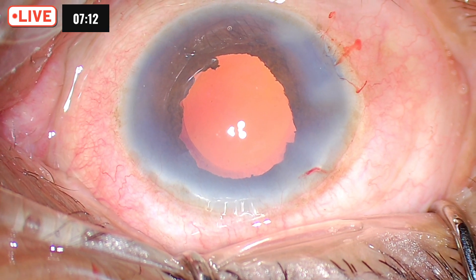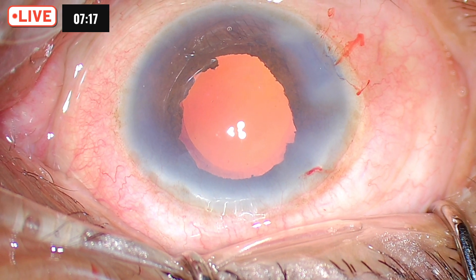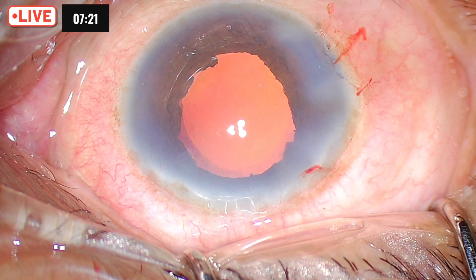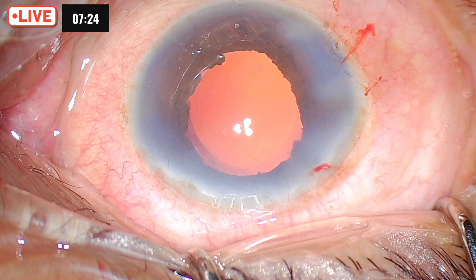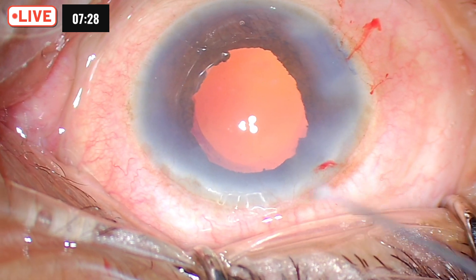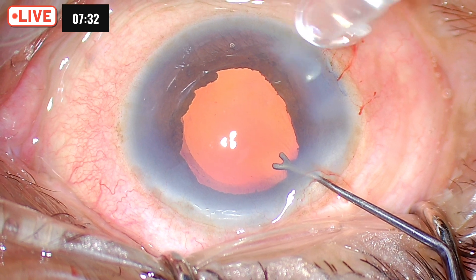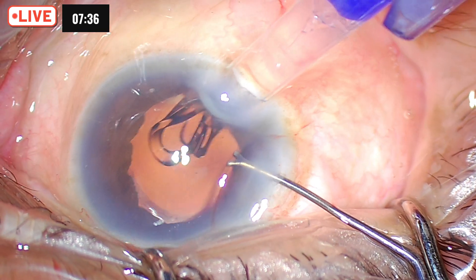I am just waiting for my assistant to load the lens — technically the surgery is over. We were planning to use a pupil expander but the patient's relatives said they would not be able to afford the procedure. Now we just go and put in a hydrophilic lens, though of course a lot of my viewers would not agree with using a hydrophilic lens, but that is the patient's choice — we have no option.